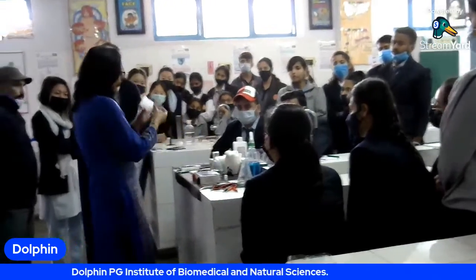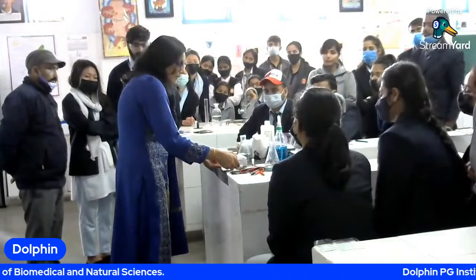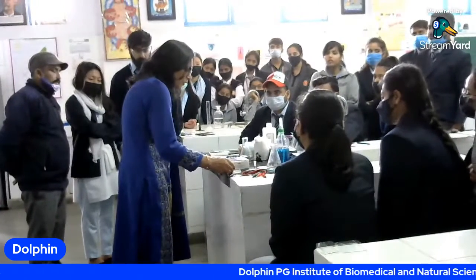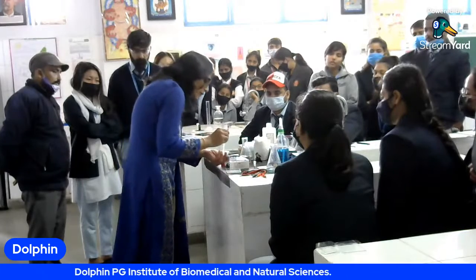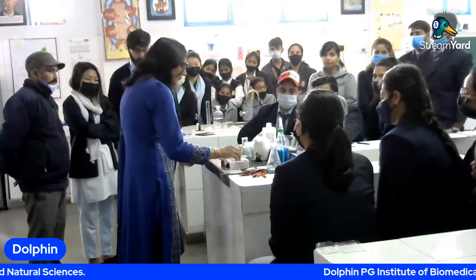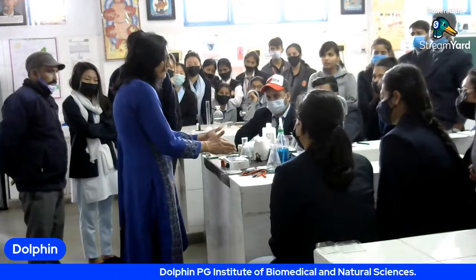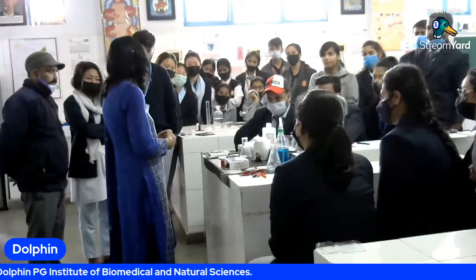So you are having the template. When you make the gels, keep this template in there. Stencils, we can call it stencil. So you will keep this stencil and then you will puncture out the wells. Then you will load your antigen and keep it inside the assembly. You will add the buffer and switch on this assembly.